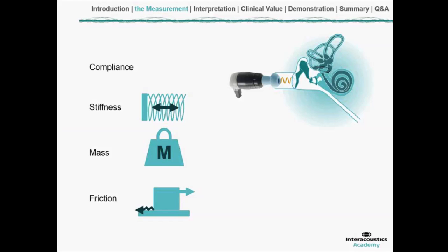In an adult ear, with the frequency that we use today for doing tympanometry, it is the case that the middle ear is stiffness dominated. It means that the curves that we measure mostly say something about stiffness of the middle ear, and that is why many clinicians have a feeling that a tympanogram is literally showing the flexibility or stiffness of the eardrum and the middle ear. This is not correct. It's approximately correct for adult ears.